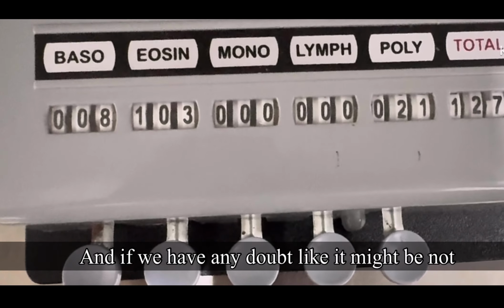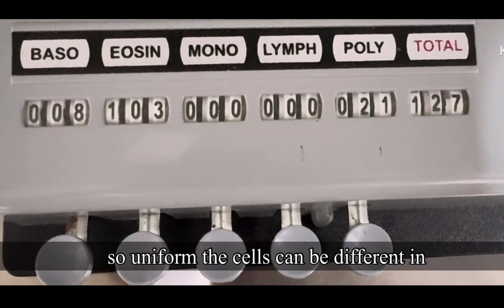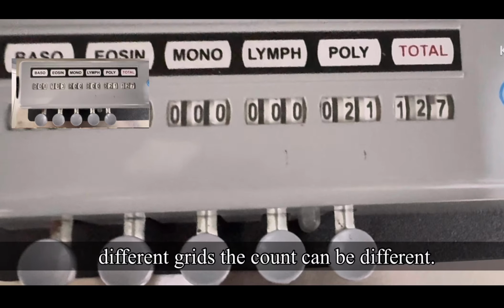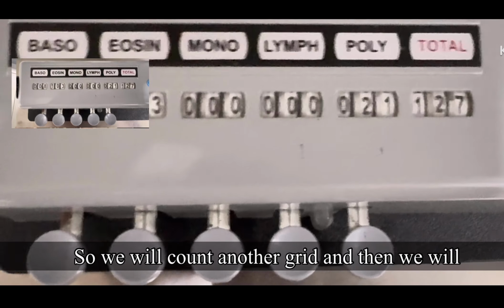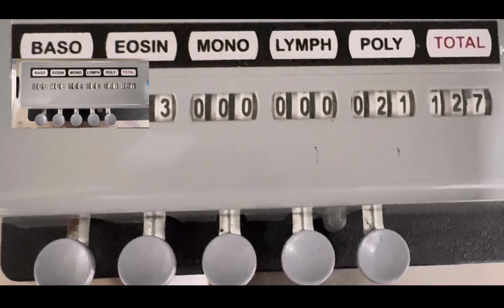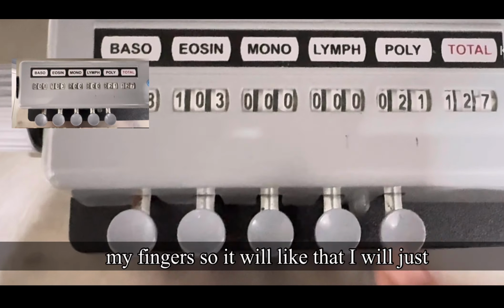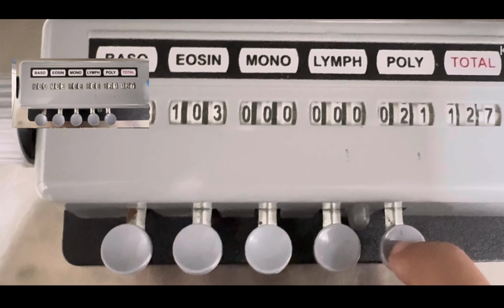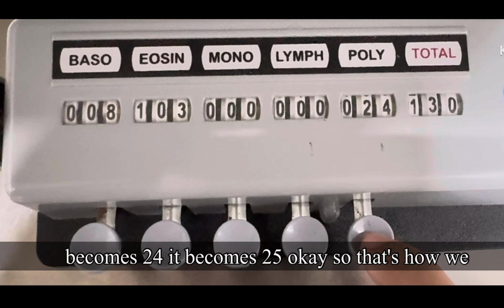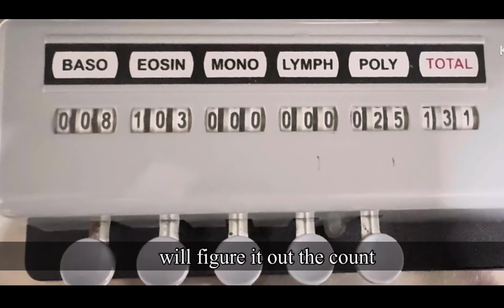And if we have any doubt, like it might not be uniform, the cells can be different in different grids, the count can be different, so we will count another grid and divide by 2, so the average will always be considered as the main value. And if I keep counting with my fingers, it becomes 22, 23, 24, 25. So that's how we will figure out the count.